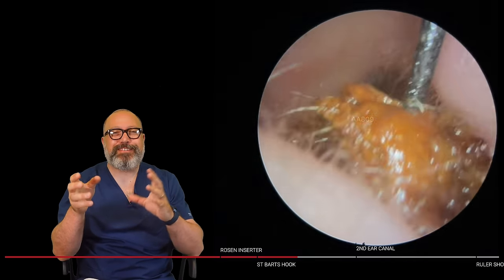Patient could already hear much better because as soon as you start taking these bigger plugs out, my goodness me, look at the size of that one, and we create a gap around it, that's when the patient can start to hear better. I can see there's more wax further in as well. So we are still going on this ear canal. There, I can just see a glimpse of the eardrum beyond though, which is great.